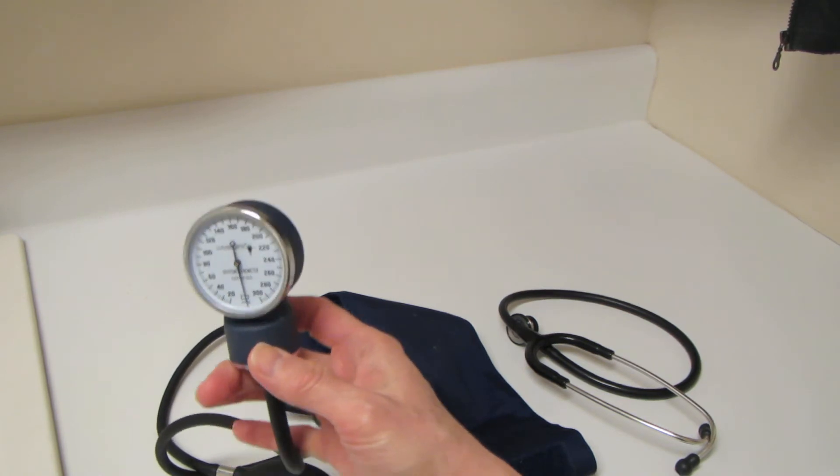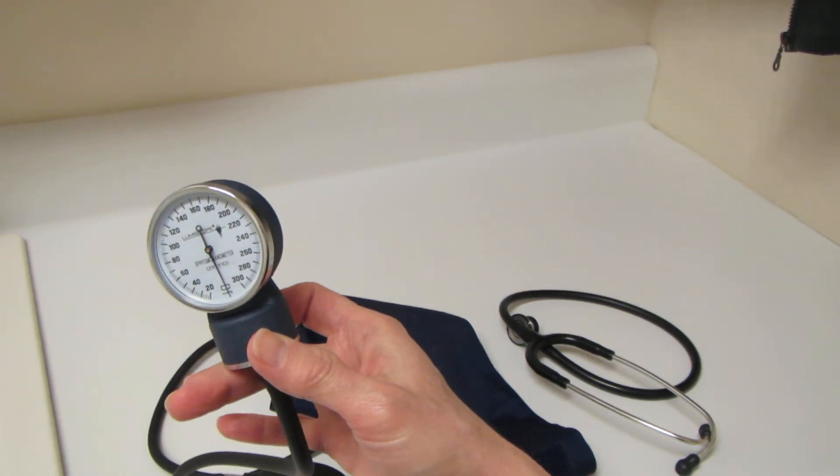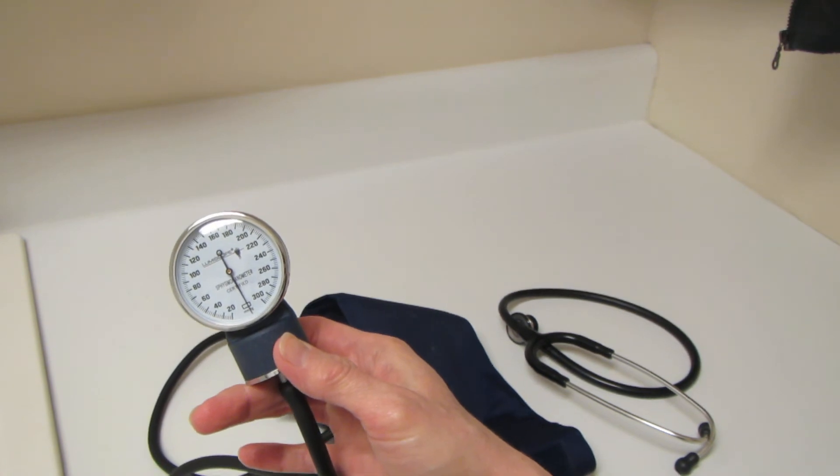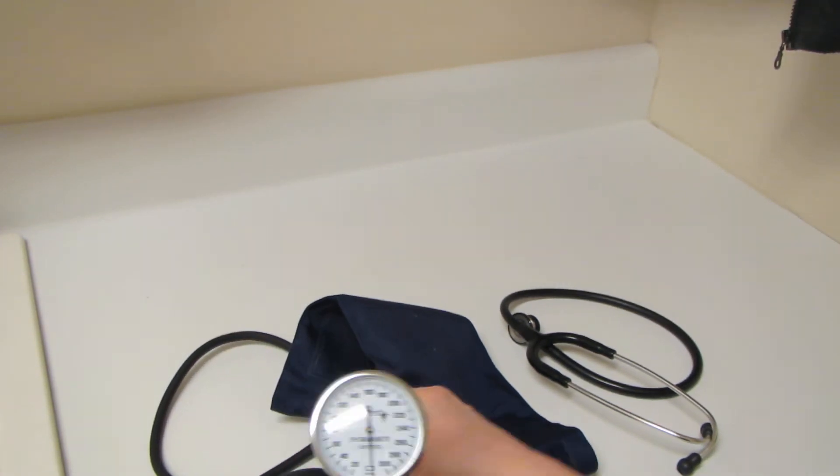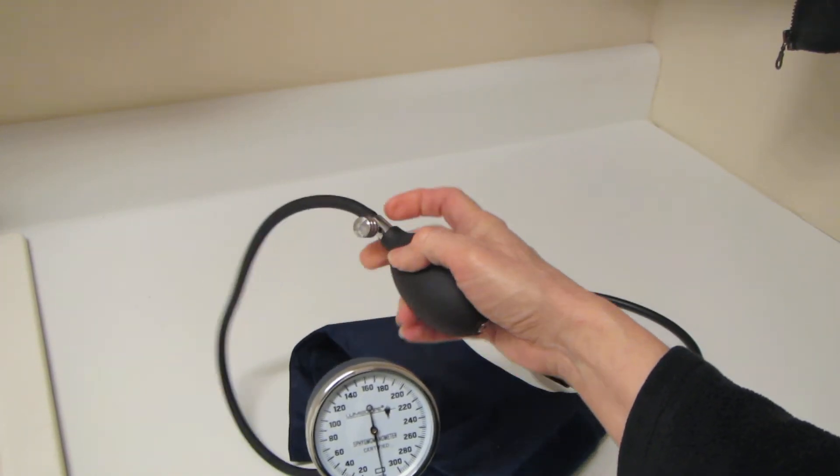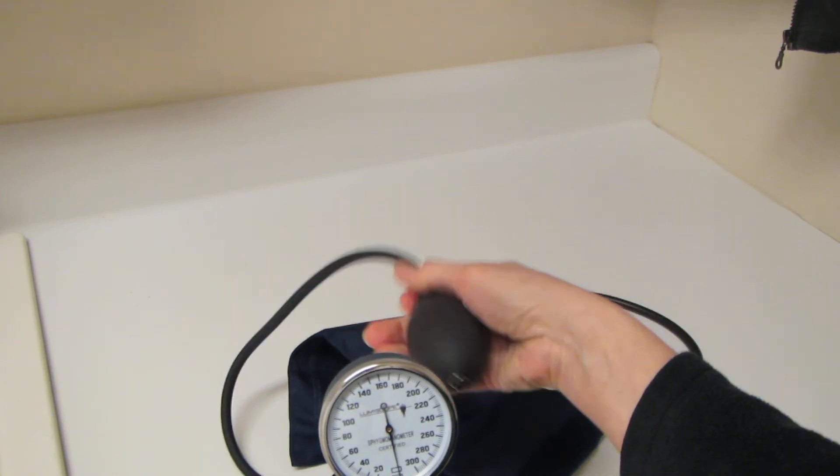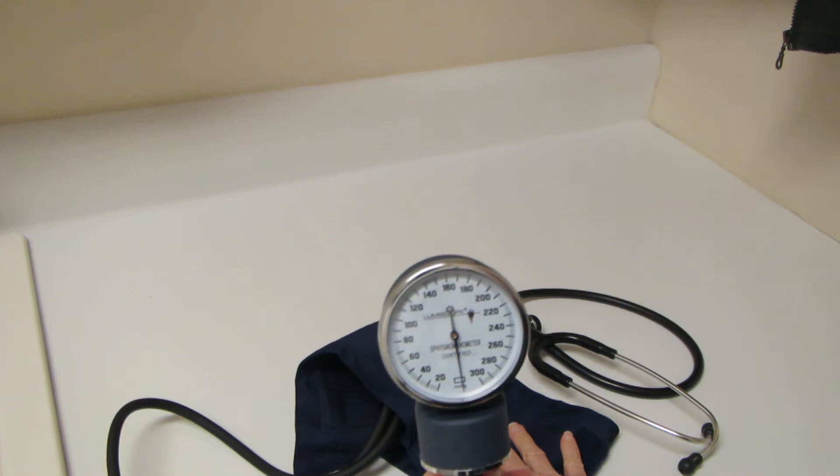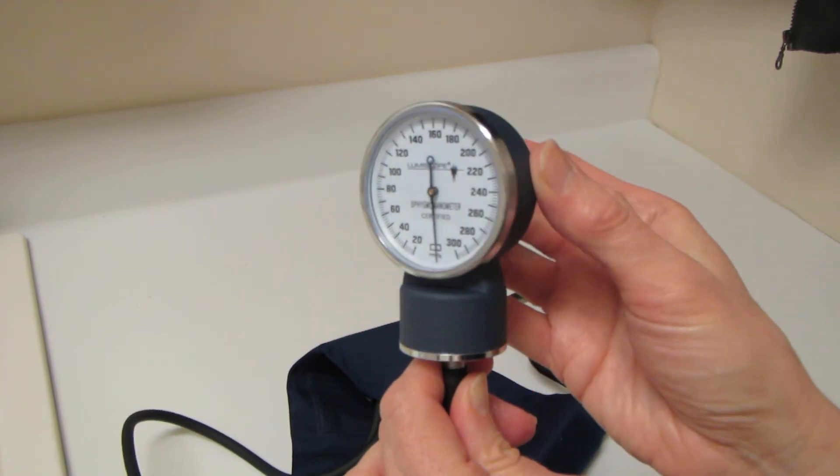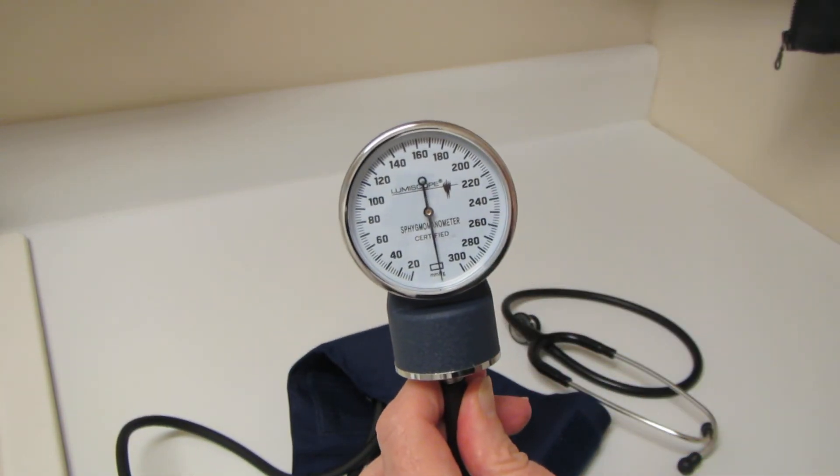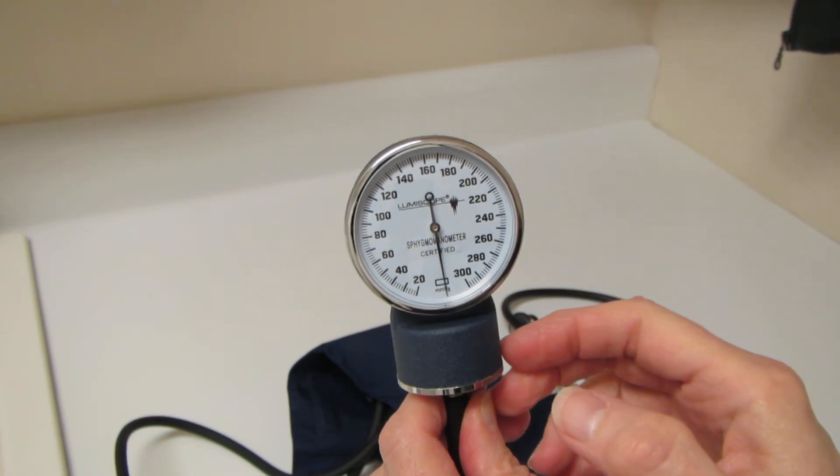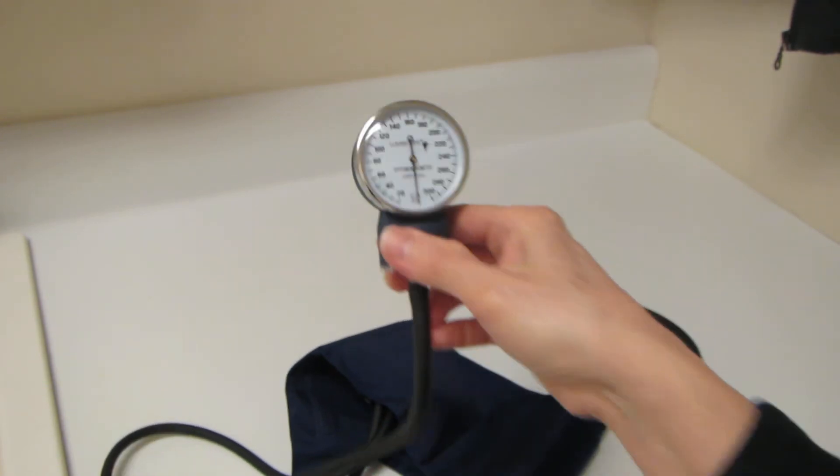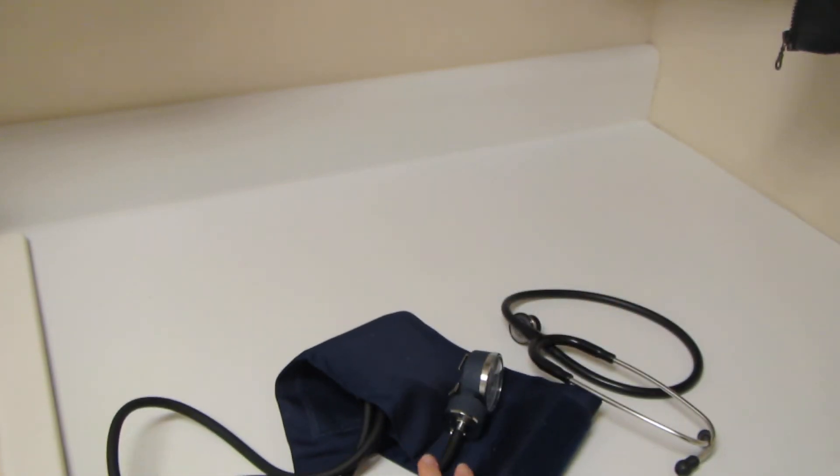Now the third part is this pressure gauge. This is what we're going to use to measure pressure changes. We're going to tighten that down and squeeze the bulb, forcing air into the cuff, and use the sphygmomanometer's gauge to measure those pressure differences.